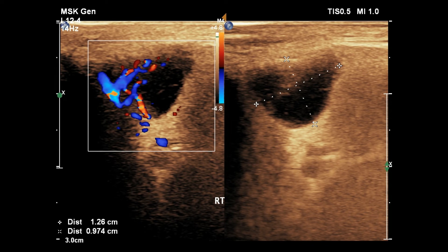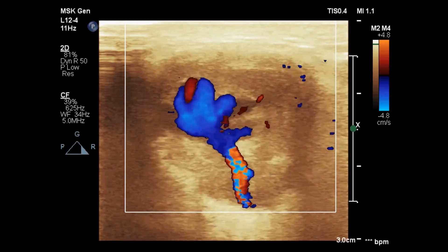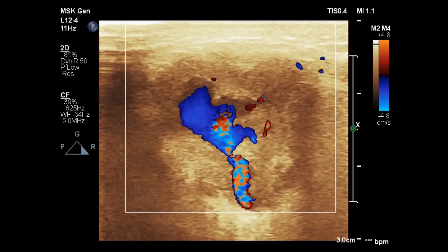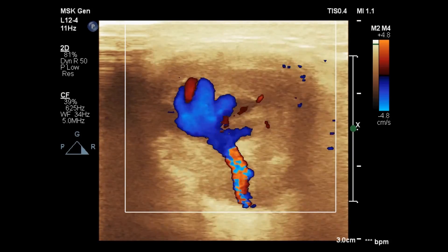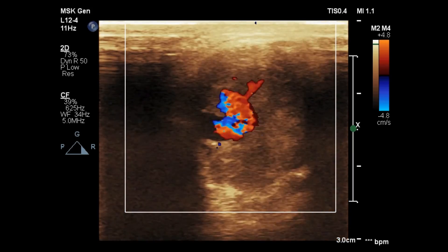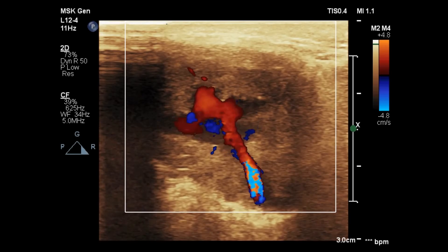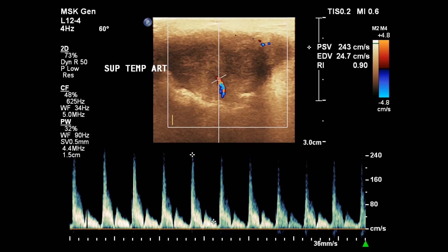This is the smaller mass. Here is the Doppler video footage showing highly pulsatile flow. The superficial temporal artery shows significantly high flow velocity. Peak systolic velocity was about 243 cm per second.